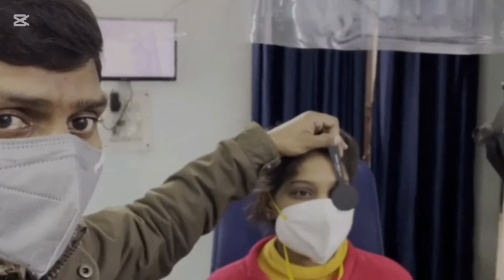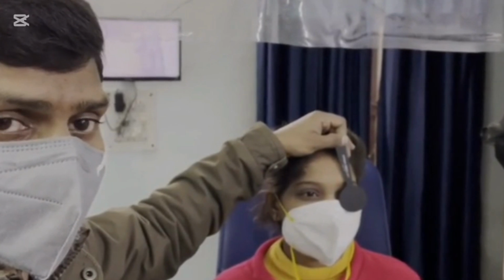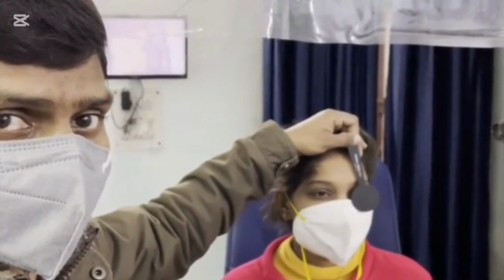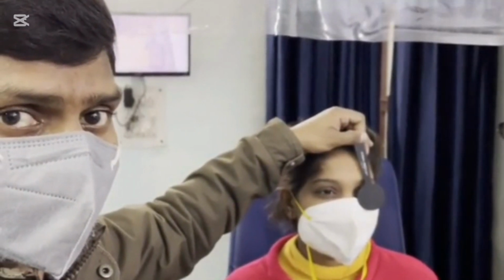Now coming to the procedure. For testing visual acuity, the patient is seated at a distance of 6 meters from Snellen's chart so that the rays of light are practically parallel and the patient exerts minimal accommodation. The chart should be properly illuminated, not less than 20 feet candles.